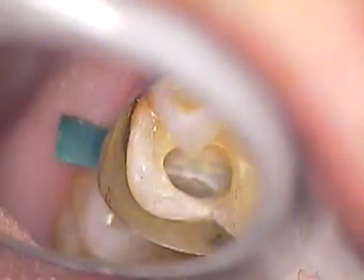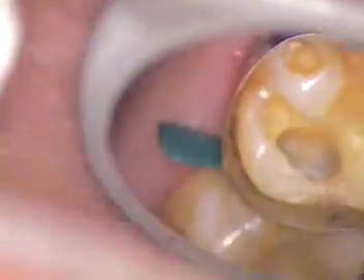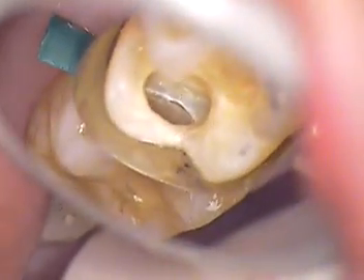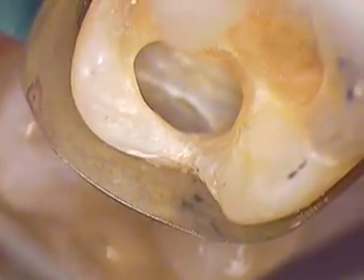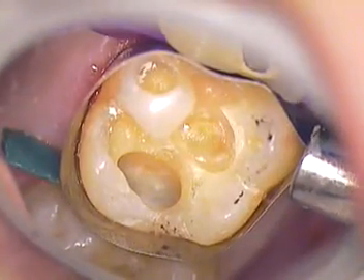Hello everyone, this is Dr. Jerry Cuomo. We're here at tooth number three and we're doing a little repair of number two right next door. You can see the tunnel preparation that we've committed to doing to give our patient a little stronger mesial marginal ridge. Here's our tunnel prep and we've already placed the Vitro Bond material.